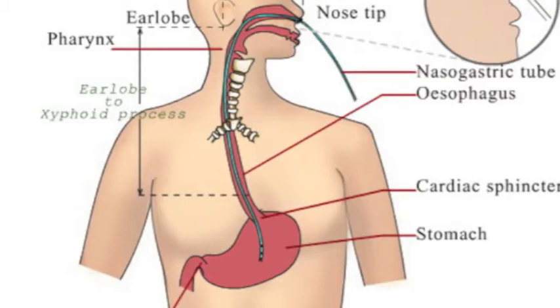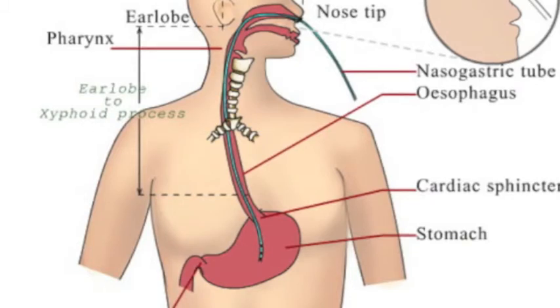So you let the patient know you have an order. Always check your order before you go snatching out a tube. Check your order. Let him know you're going to take it out. You give him a towel. I tell him to hold the towel like between here and here, so hopefully they don't throw up when I take it out. But it's more or less for the nose. So you clamp this, empty your canister, pour your last whatever. You gently take it off.